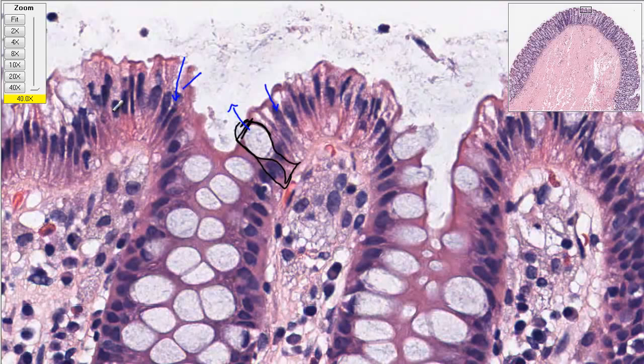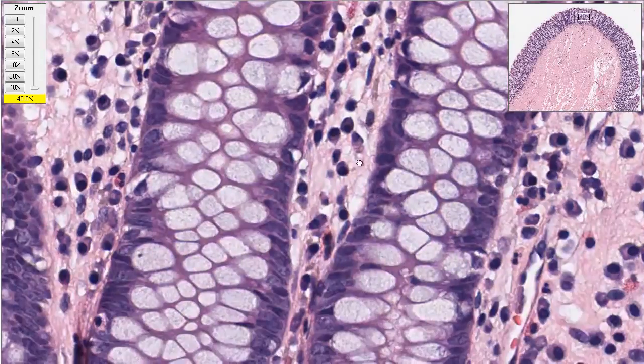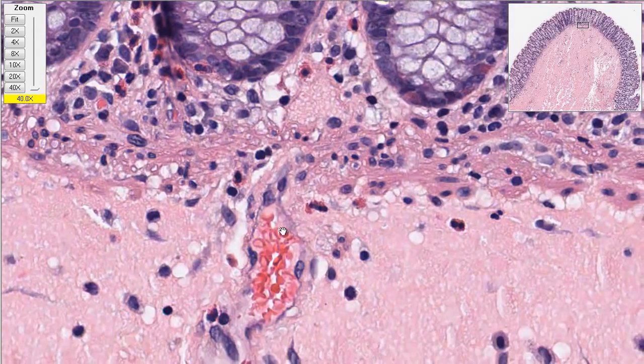Just to get a perspective of where we are, I understand the whole thing is about half a centimeter wide. What's our scale? How big is one of these cells? Our favorite scale bar is to look for blood vessels, where these are red blood cells. That one right there is 7 micrometers in diameter. A micrometer is a millionth of a meter, or a thousandth of a millimeter. So let's round off to 10, about a hundredth of a millimeter. Put 100 of these next to each other and you get a millimeter, which would be bigger than our entire screen.